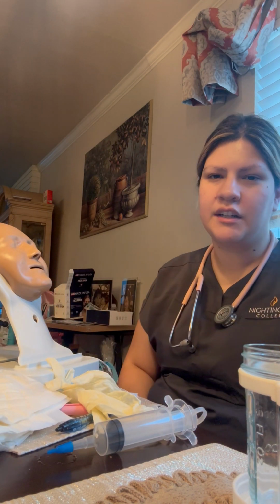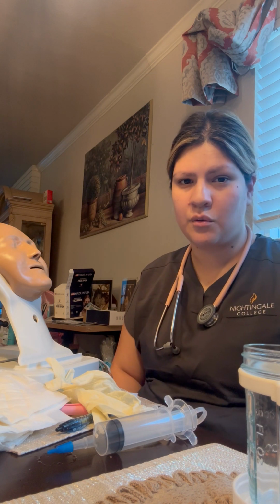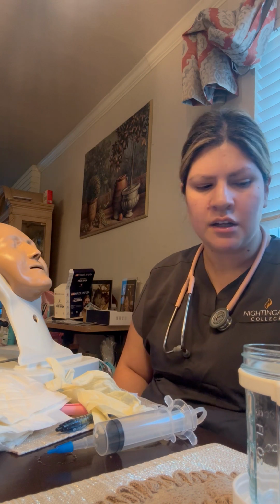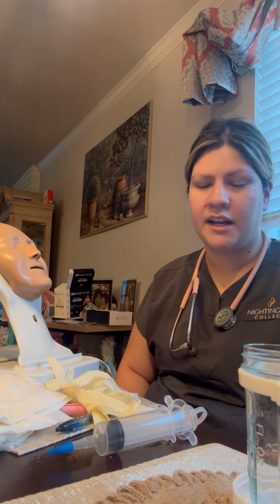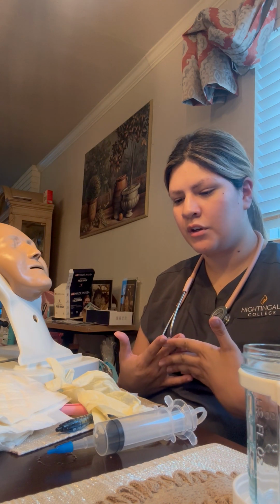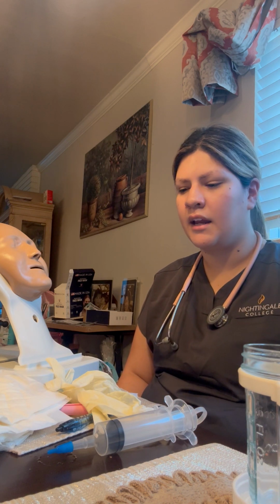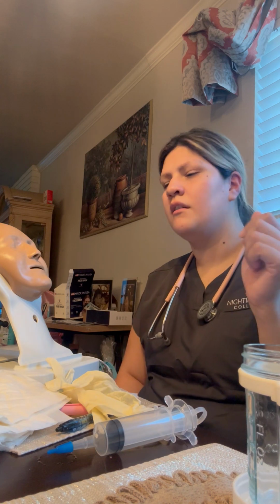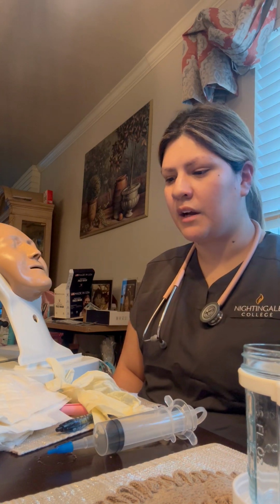So first things first is I'm going to verify physician's orders, making sure that we have the correct orders in place to go ahead and do the NG tube. Okay, so I'm looking at the orders. Orders are in place. I'm gonna go ahead and knock on the door. Knock, knock. I'm gonna close the door, close the curtain behind me to maintain patient privacy.